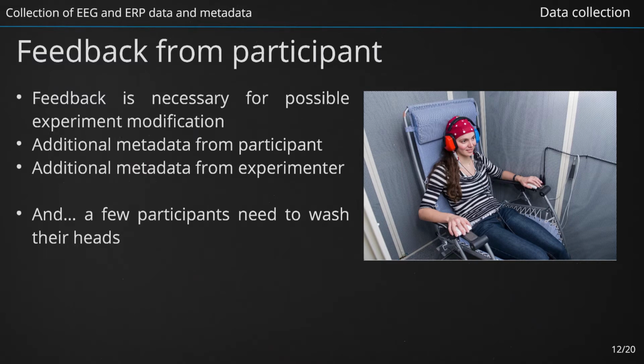These kinds of metadata could, for example, describe any non-standard behavior of the participant or the infrastructure during the experiment that can influence the interpretation of experiment results. The last step is also very important for participants. They are provided with head cleaners.